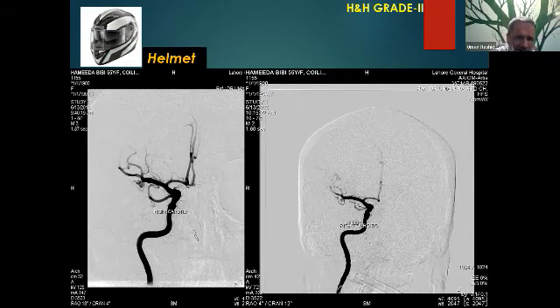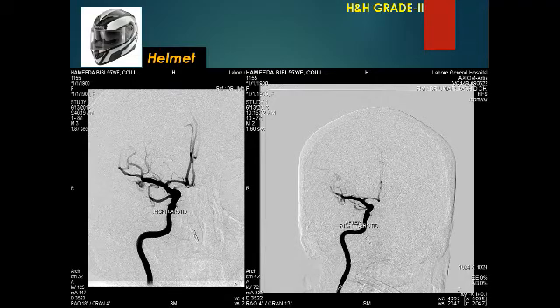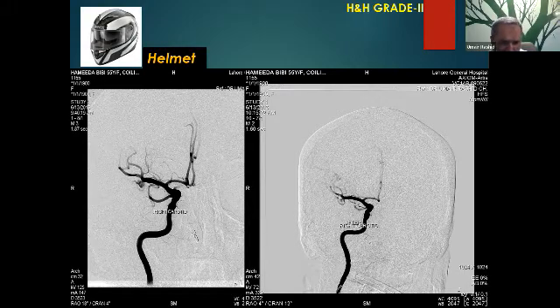So this is a helmet. Helmets are nowadays very important in my country too; they can't drive a motorbike without using one. But this helmet could help describe this shape. It is present in the perianeurysmal architecture after the bleed. You could see there's a bleb along with the aneurysm, giving you a look of a helmet shape. So accordingly, again, it could help in the selection of simple coiling.